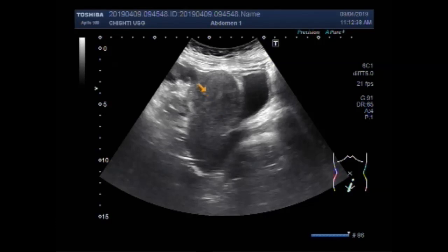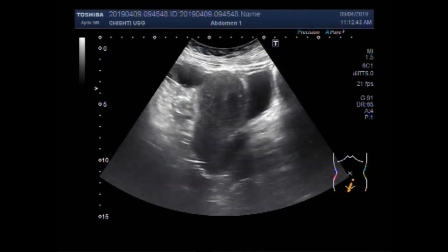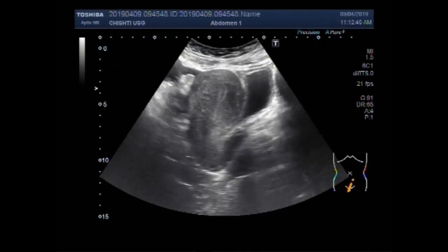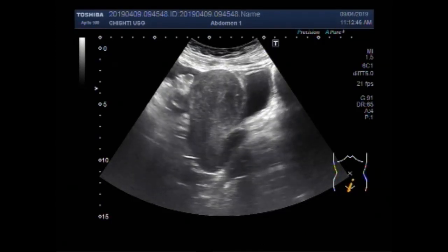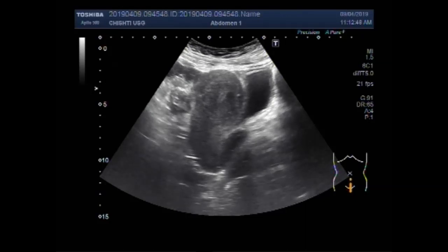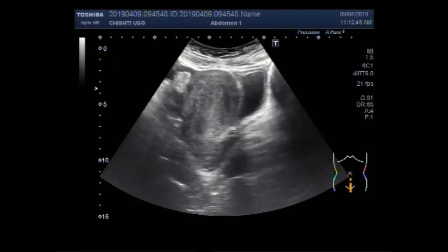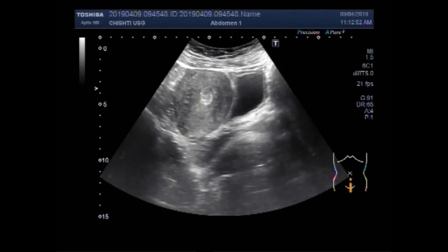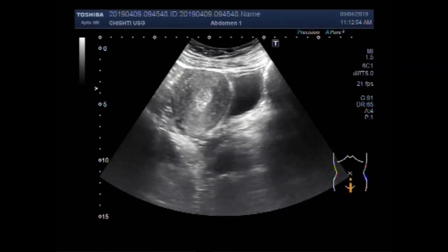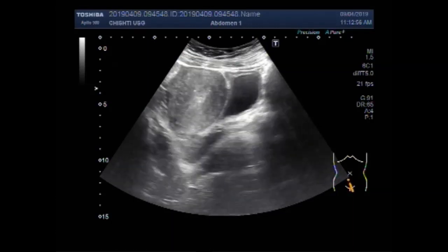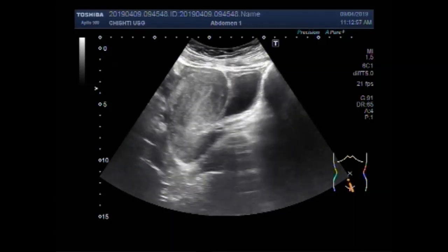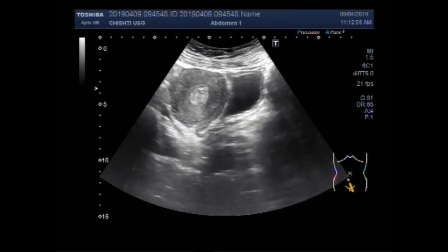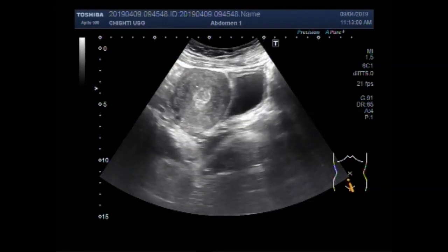Now this is the uterus, and this is the urinary bladder. You can also see a mass in the distal portion of the uterine cavity.